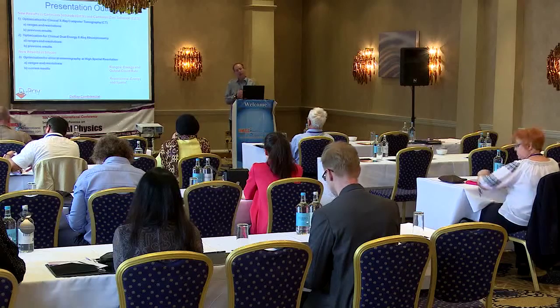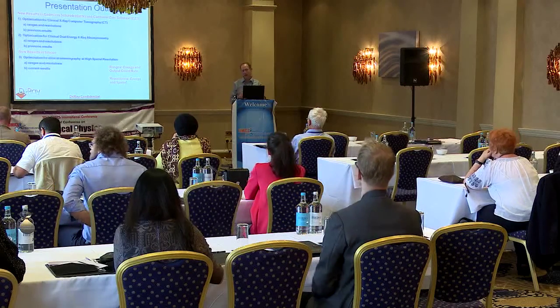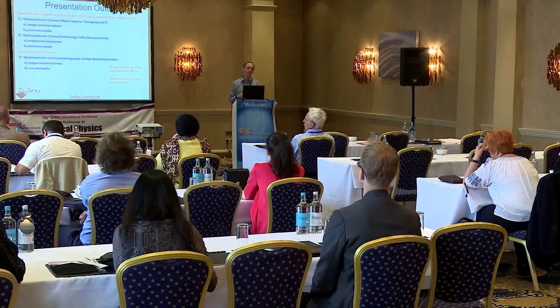And in going over these applications, we'd like to talk about the ranges and resolutions that are required for the applications and show how new detectors are able to count individual photons and bin them according to energy in these applications, and this was previously unachievable.